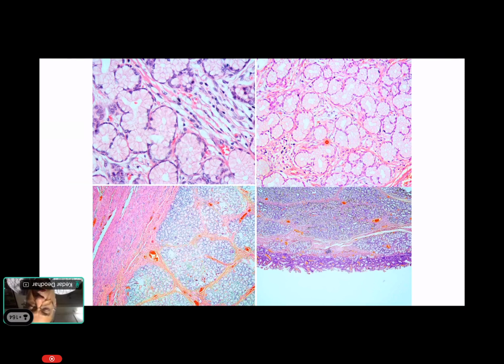Generally, Brunner's gland hyperplasia or hyperplastic change can impart nodularity to the endoscopist, and it may look like small raised nodules, like a neoplasm. These are the same appearances on endoscopy with small neuroendocrine tumors or tumorlets. So just remember that Brunner's gland hyperplasia may be seen on endoscopy as a fine nodularity.